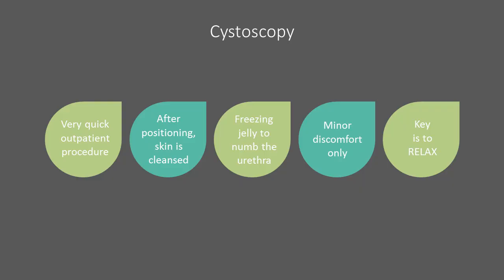After positioning, the skin is cleansed and freezing jelly is passed into the urethra to numb sensation. Most patients should experience minor discomfort only, which is minimized by taking deep, slow breaths and relaxing, especially the pelvic muscles, as much as possible.